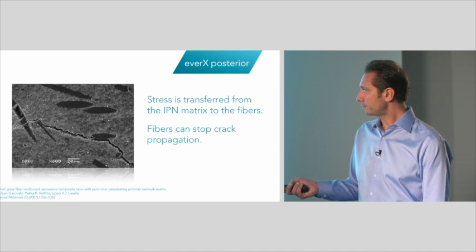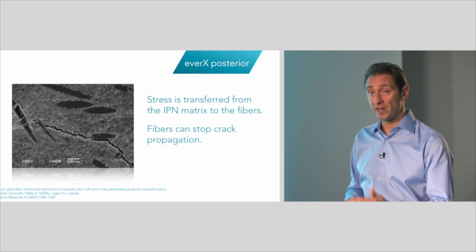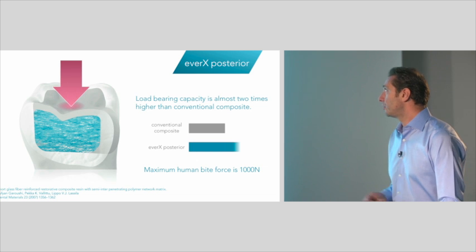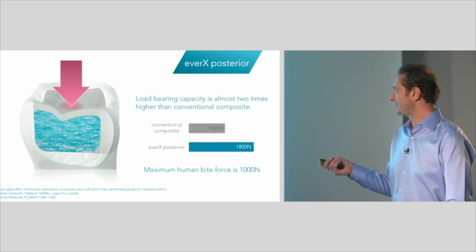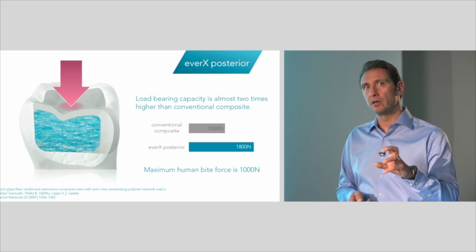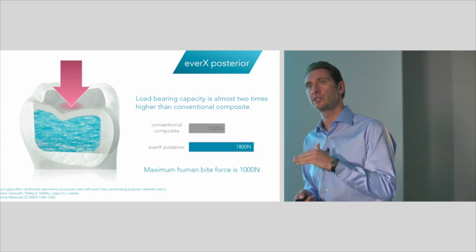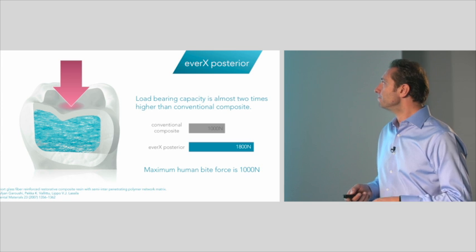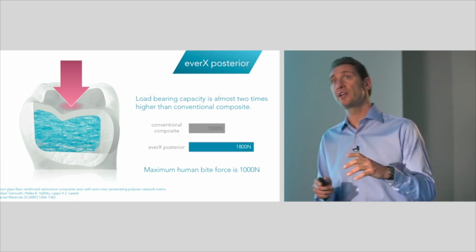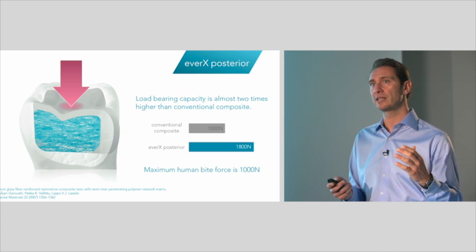So this mechanism is the key to all the advantages that we are going to touch and see. So, as I said, load-bearing capacity is high, and it's on a very delicate level, as you know, because it will allow us to create a restoration, to create even a tooth restoration complex which is able to withstand forces.